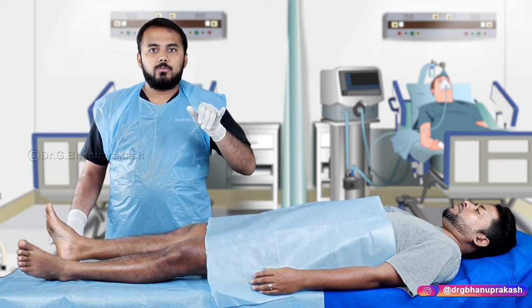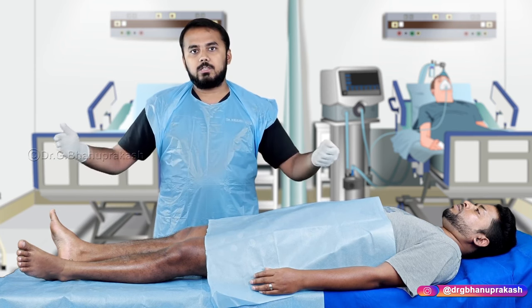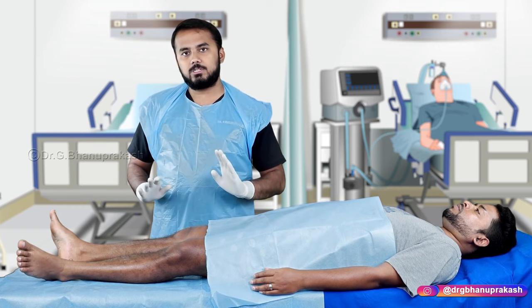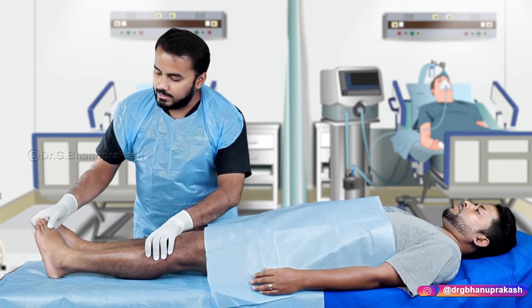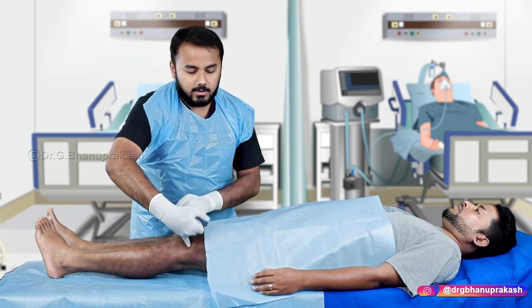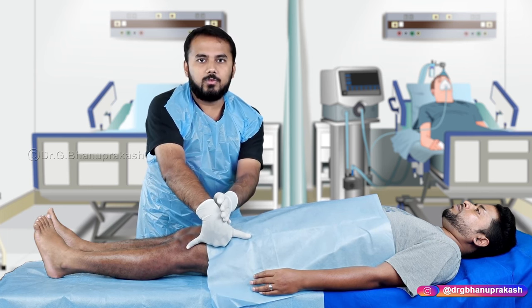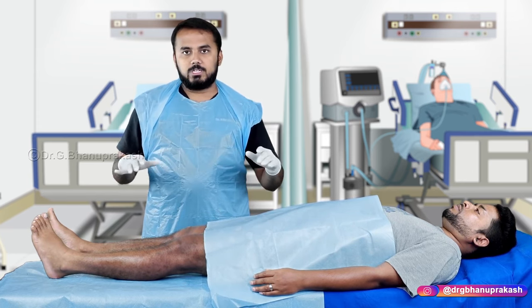Once you have the count of four, you unroll the POP and mark that length. On the lateral side: one, two, three, four — about three and a half. Padding is applied the same way: starting from the base of the metatarsal, rotating the cotton pad from distal to proximal, with each turn covering 50% of the previous one.